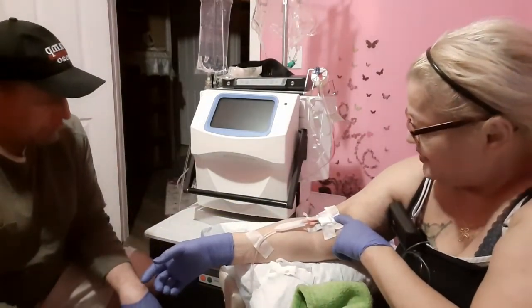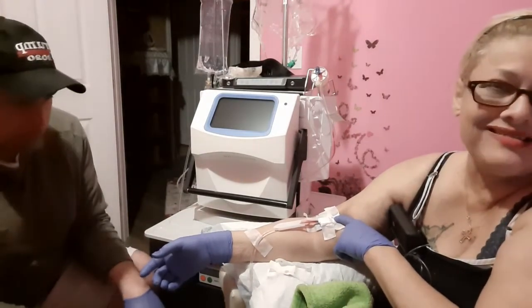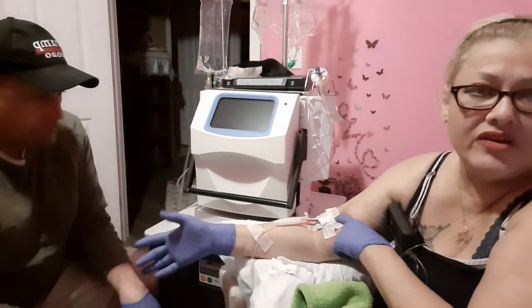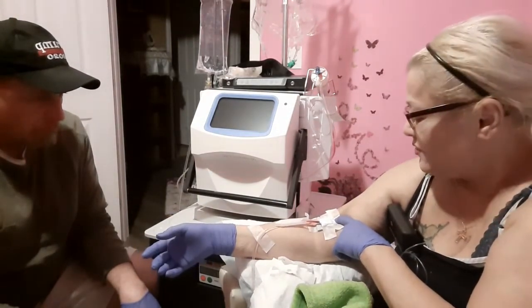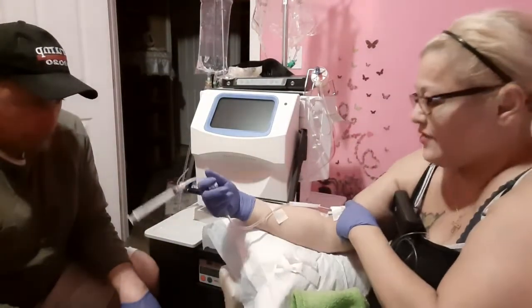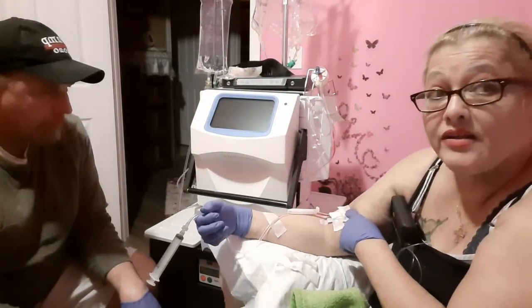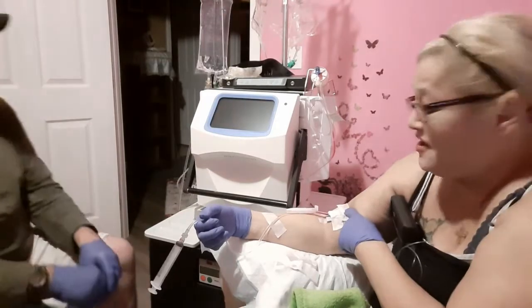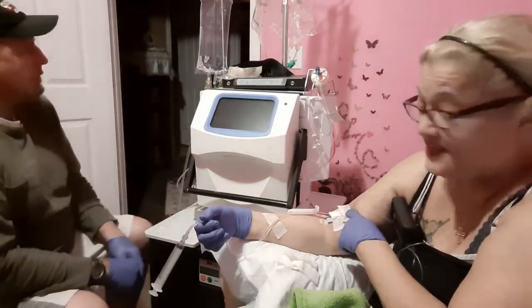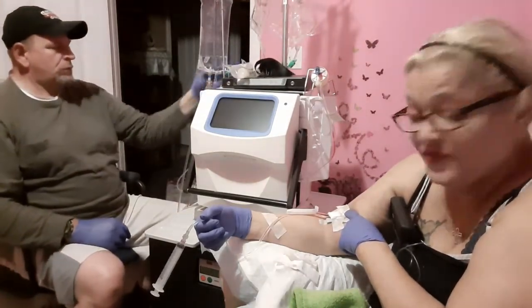the needle site. So I just press down. And it usually takes about a minute or less for it to clot and stop bleeding. So that's one. Okay. Let me go ahead and get ready on this one. And I'm surprised Artie didn't squirt, because he's a gusher. The arterial on me is definitely a gusher. But they behaved today, both of them.